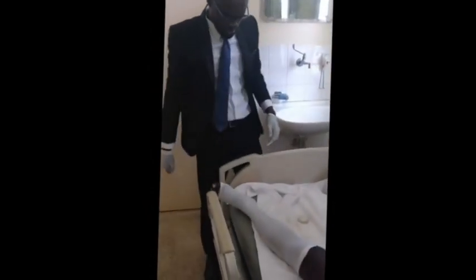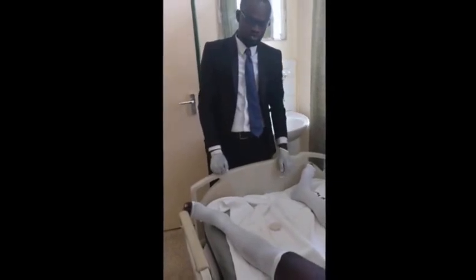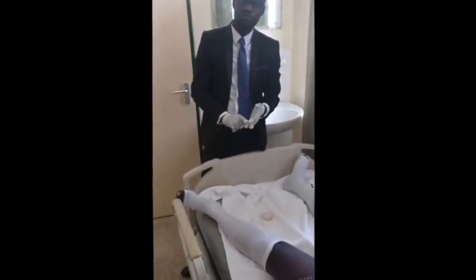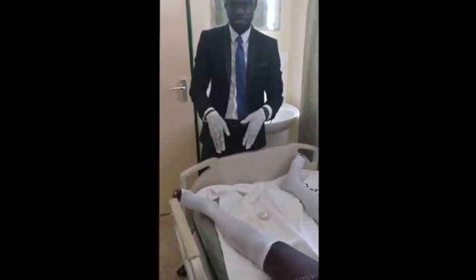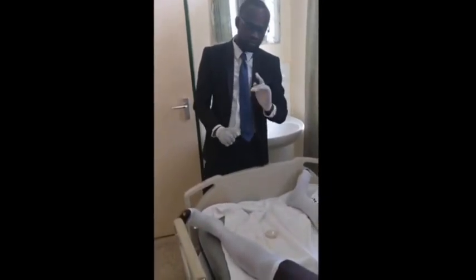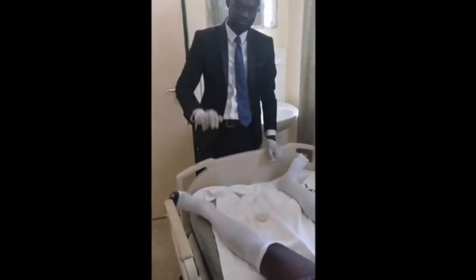Once we've fitted it in this way, we need to examine the limbs about twice a day to ensure the stocking is not causing any tourniquet effect or any form of irritation. We ask the patient if there's any pain or discomfort. If the patient can't talk, we need to take the stocking off and re-examine, make sure there's no edema, and check whether the indication for the stocking has changed, whether we need to take it off or not. Also, the stockings should be changed every 2 to 3 days, and also when soiled. That's why I prescribe pairs.